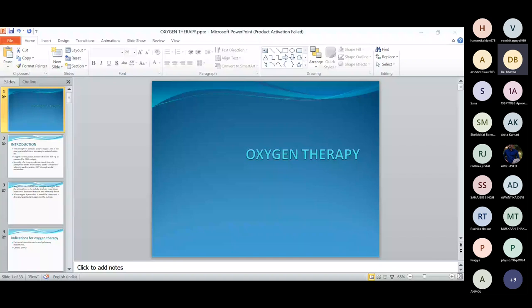The exhaled air containing CO2 is vented through the open port on each side of the mask. So when the patient exhales CO2, it is released from the vent. It can deliver an oxygen concentration of 70-80%, and requires a flow between 7-10 liters. You can see the oxygen you are delivering is 7-10 liters, which is more, right? And the patient is also receiving more, which is 70-80%, to keep the bag from fully collapsing during inspiration.